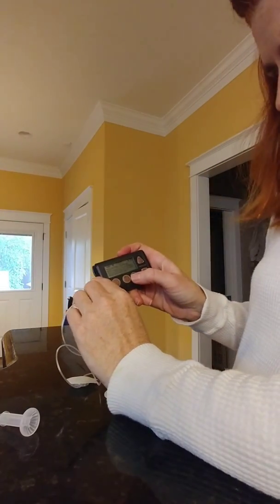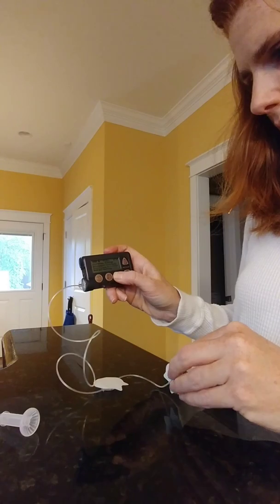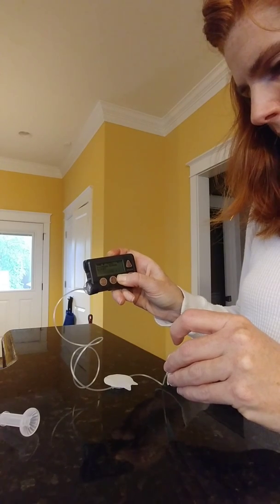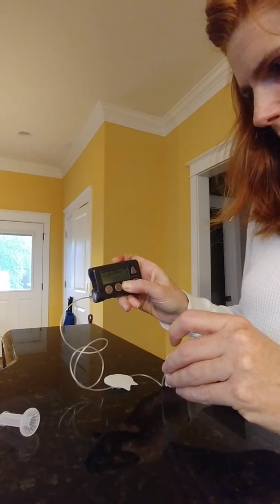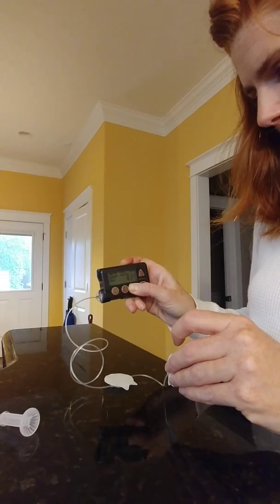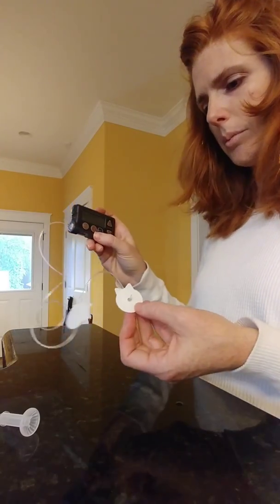So on the pump screen, we're going to go back to prime. We're going to hold act down to prime, and it tells you on the screen, hold act to prime. Gives you a little warning that you shouldn't do this when it's on your body. And you just hold it down until the beeping becomes faster, and then it shows you how many units you're priming. So I'm looking at the end of the site. It takes about 5 to 6 units, and I just waited until there was a drop of insulin coming off the end of the site.